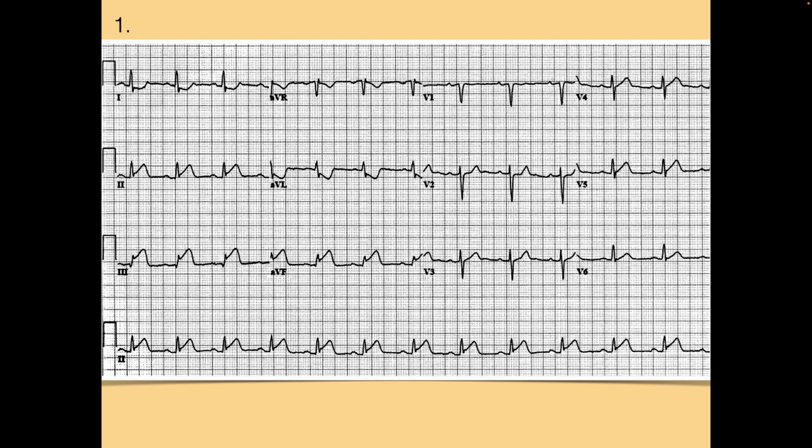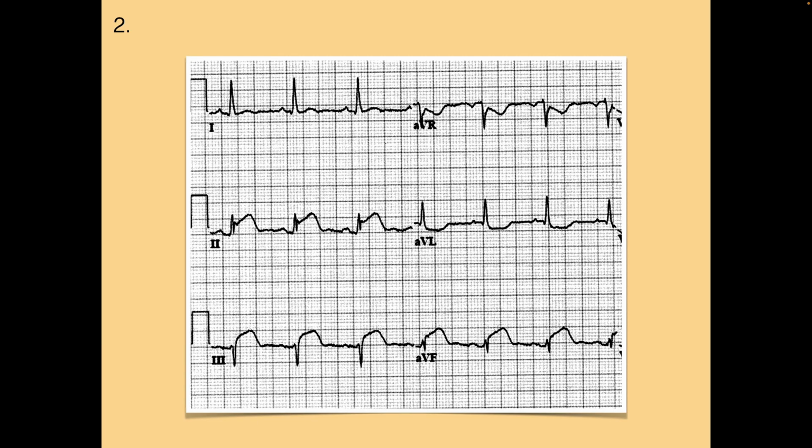Is this a different one? Yeah, this is a different one. Okay, so here's another one. So why don't you pass the pointer on to somebody? So Eli, do you want to show us? This is an inferior STEMI. Just show us where the elevation is, please.